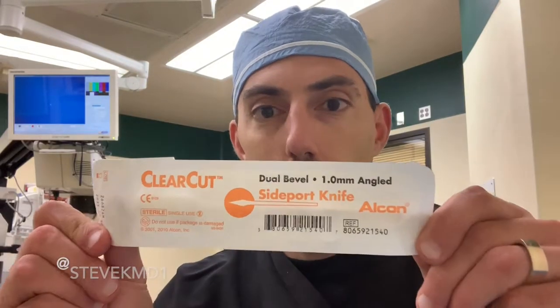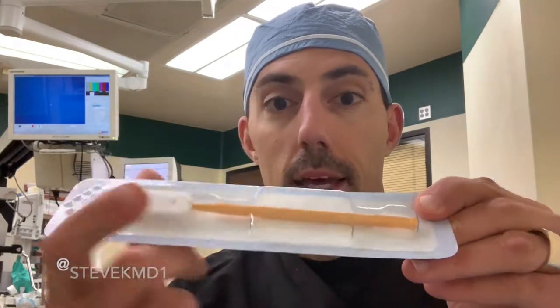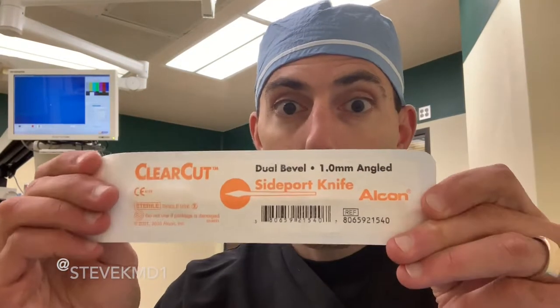So cataract surgery — the first thing we do is we make a side port incision. This is pretty universal, but there's going to be slight variations depending on the surgeon. The blade we use for that happens to be this one. It's a one millimeter side port blade. This one happens to be yellow. It is kind of my favorite side port blade.